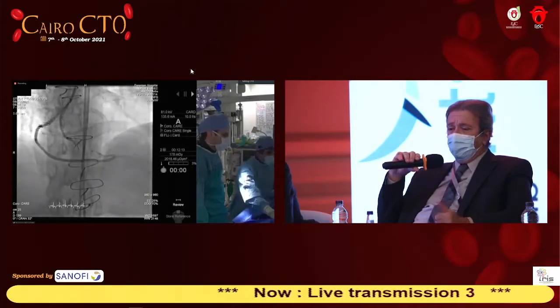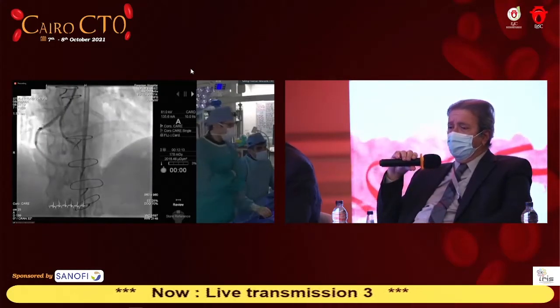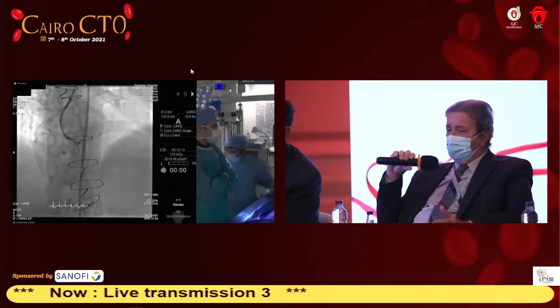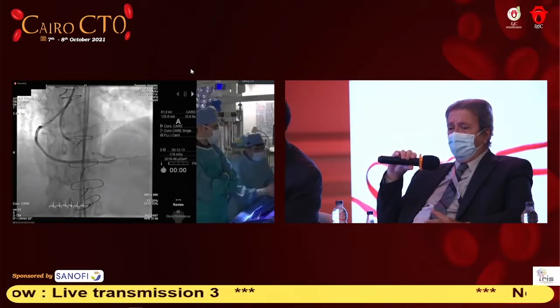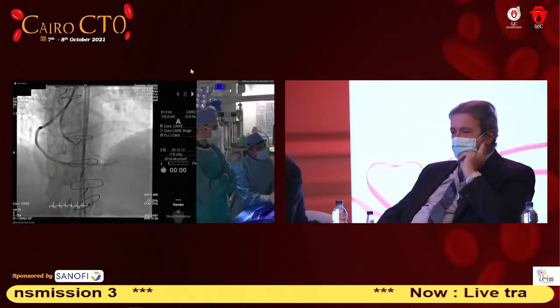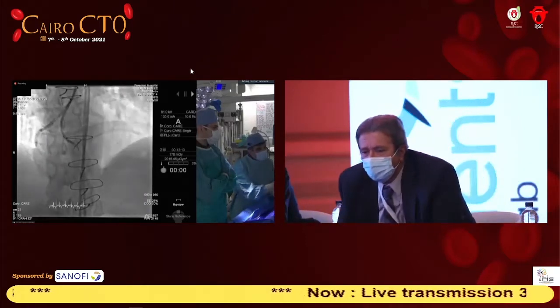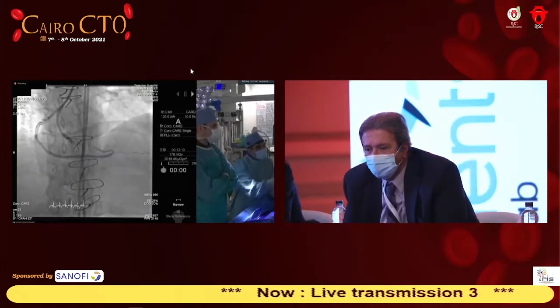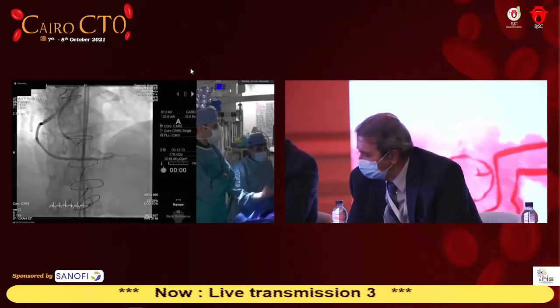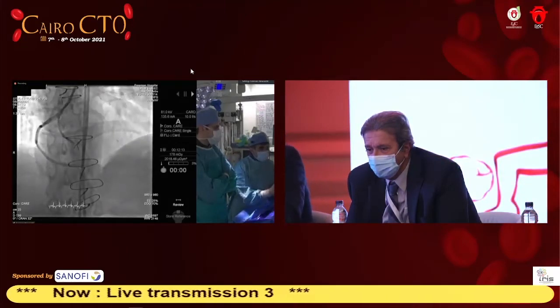Absolutely. That's our advice to our CTO operators here in Egypt, that for retrograde procedures, you should have help from a retrograde expert. So that's what we do here. And even for the retrograde itself, it depends on what collateral you are using. The safest way for somebody who wants to start doing retrograde, a vein graft is really the safest and the easiest way to do it, because it kind of gives you a safety.